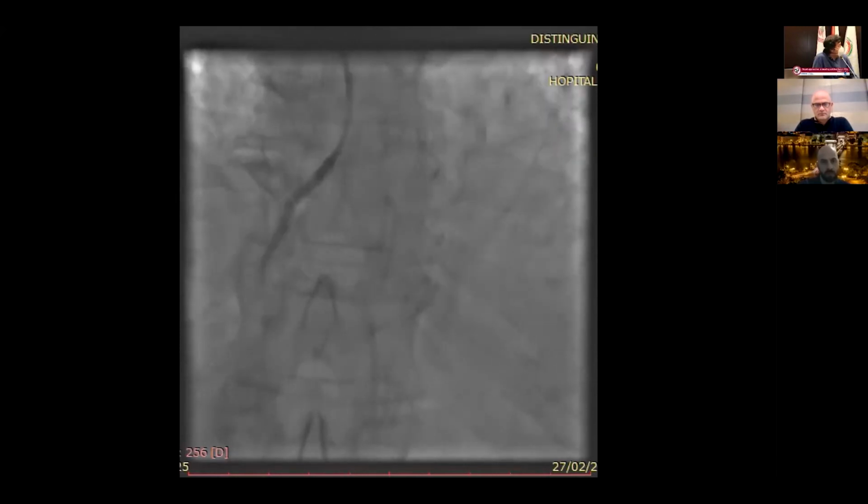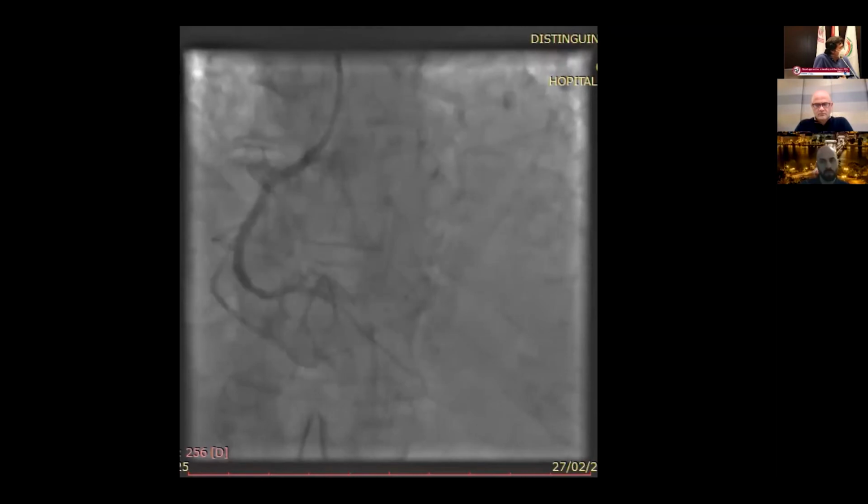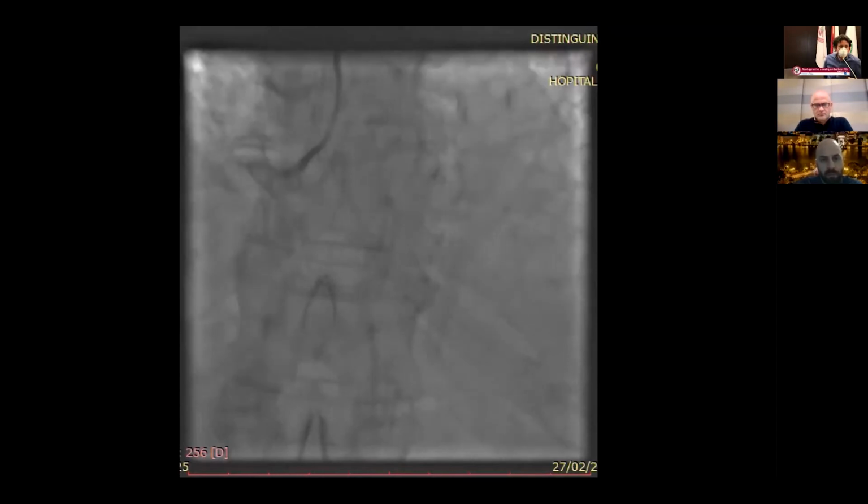Did you do ballooning after rotablation? Because we know that after rotablation we have cracking of the calcium, and we can optimize the lesion with the NC balloon at 1-to-1. Did you do that? Yes, yes. And even so, the stent cannot pass. Yes. I want to ask Dr. Abdallah his opinion and Dr. Idris about this case, because besides rotablation, we have, for example, a shockwave balloon that can rapidly be delivered in the cath lab. In these cases, is the shockwave balloon indicated, can it help us, or will rotablation be the standard of care in this case? Dr. Abdallah.